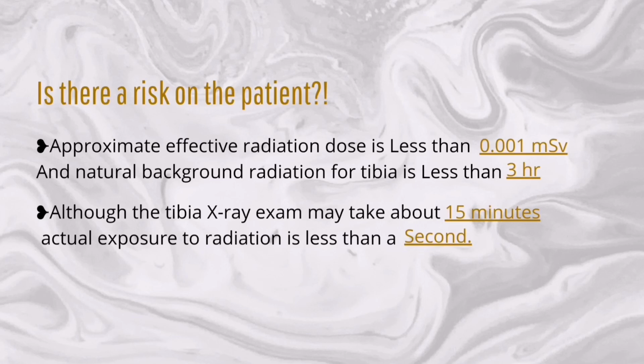Finally, it's important to know that the technologist radiographer uses the minimum amount of radiation required to get the best results.